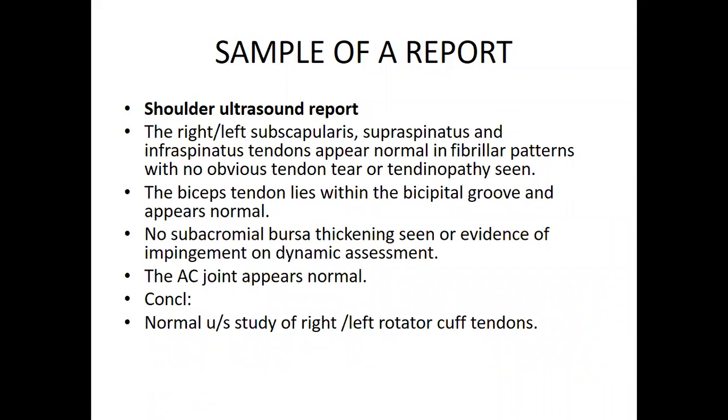When you're reporting, sometimes we tend to write a lot of things, but you have to know exactly what you are looking at, exactly what structures you want to communicate to the clinician, and what clinical question exactly you want to address. And more importantly, the patient's history is very key. Is it post-trauma? Is it a degenerative kind of history? You look at that, you communicate with the patient. So be straight to the point.